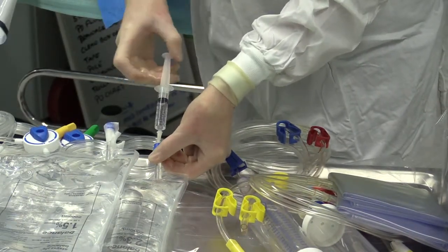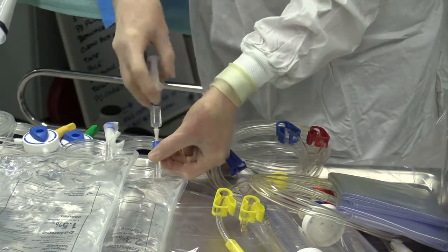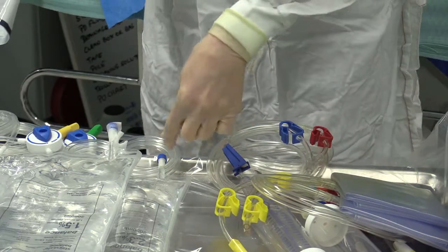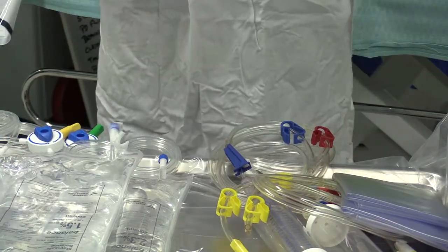Just draw back and inject quite quickly a couple of times just to clear the port, because it's quite a large injection port and the heparin could perhaps get stuck in the port and not go into the fluid.